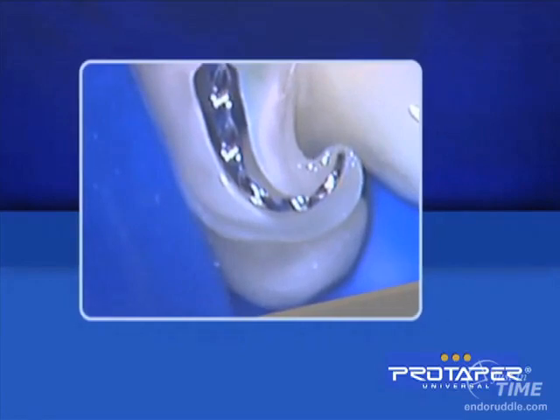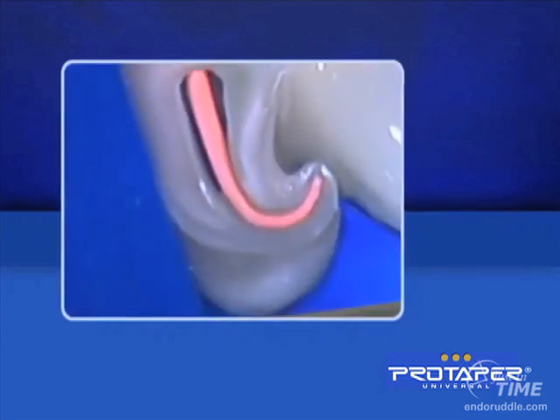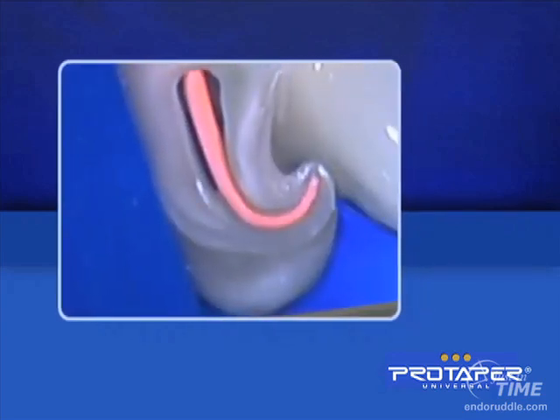Notice the finisher, the 25.08, is only engaged in its terminal extent. Notice the instrument is loose around the curvature and in the upper 2/3. That's because the shapers prepare the upper 2/3 and the finishers blend the deep shape into the body of the canal. This was done with manual ProTaper. And of course, if we have a smooth shape, it's quite easy to slide a matching ProTaper F2 gutta-percha cone around the curvature and to length.